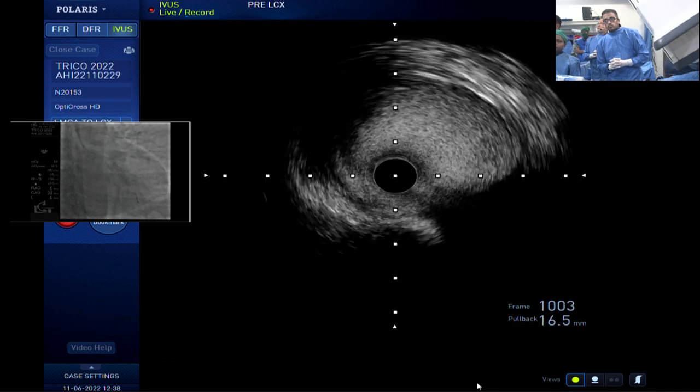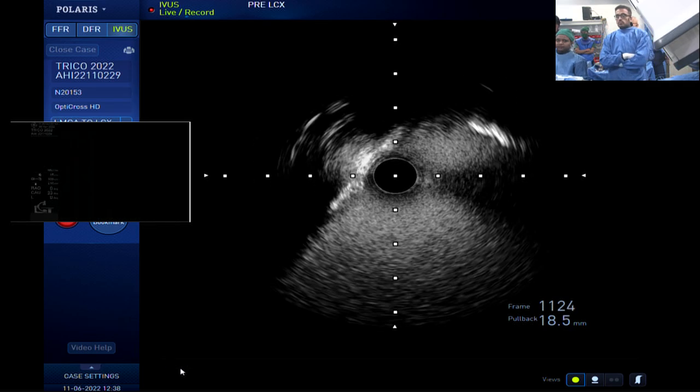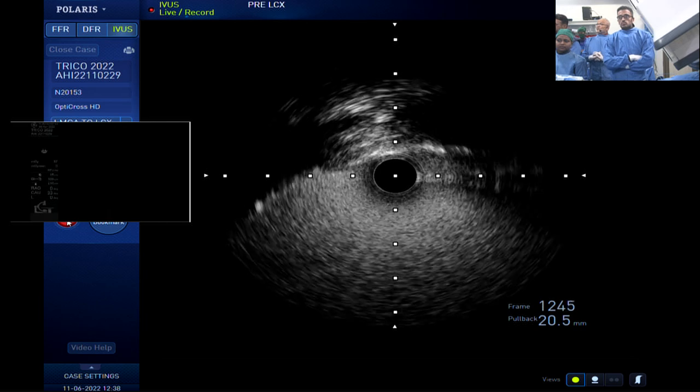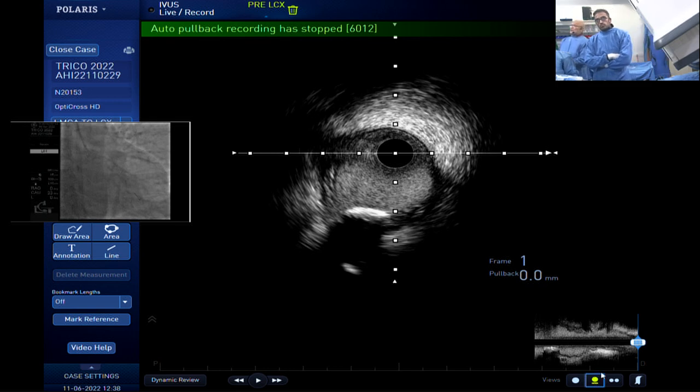As you continue to pull back, you see ostial disease here. Cine here, please. Cine. So that's good. And now you're well out into the aorta. So now you can pause and stop. Okay, and we can come back to the IVUS and let's look at the left main.